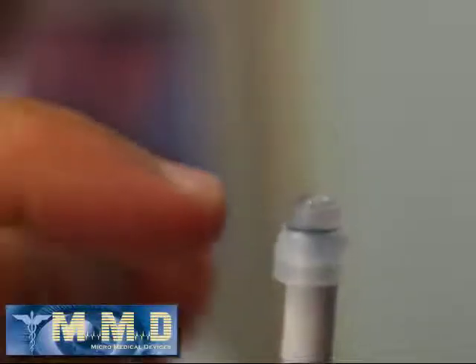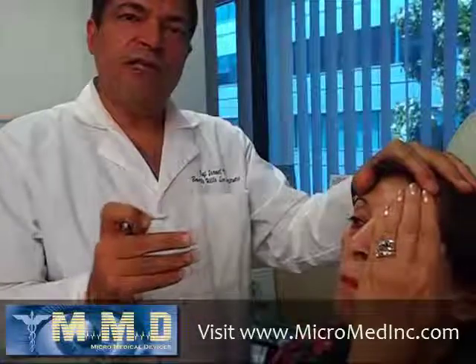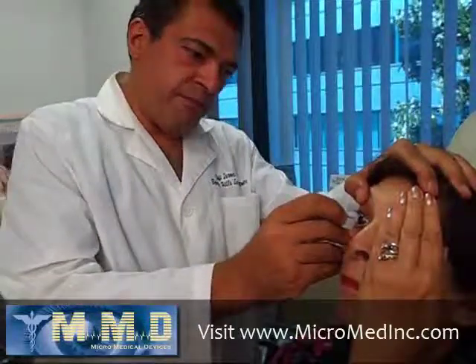So, as I said, this is just about the perfect amount of dome, and just bear in mind that when you do this exam, if you do it right, you only transfer this amount of fluid to the eye, and you keep the rest of it in the chamber. And all you have to do is introduce half the amount of drop back on the dome to do the other eye. This is how fast you can do immersion biometry using the EZ Immersion Tip. Please look at the light.